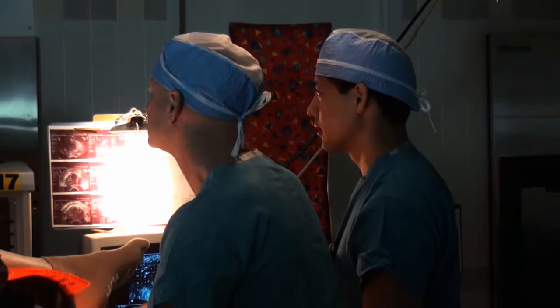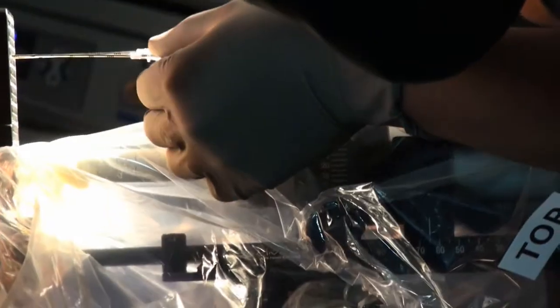So the advantages of brachytherapy are that it is a very convenient procedure. This is a procedure done as an outpatient. The patient does not require an overnight stay in the hospital. The procedure is very short. It takes us approximately 1 hour to perform the procedure. There is no cutting. Needles are used to insert the radioactive seeds into the prostate gland. Therefore, the blood loss is very low.